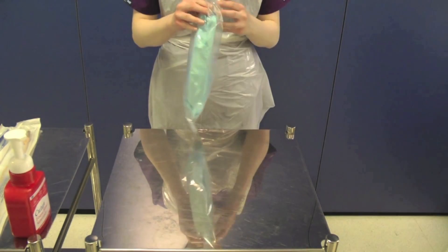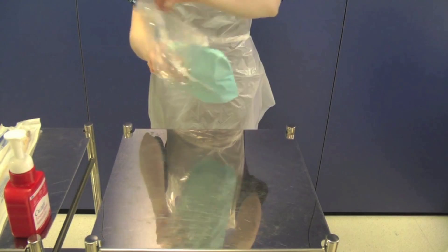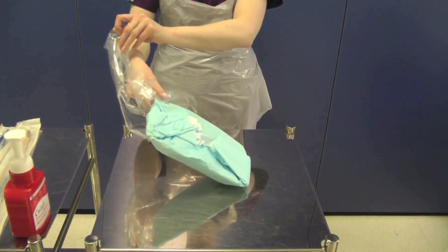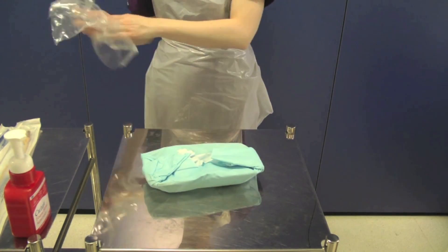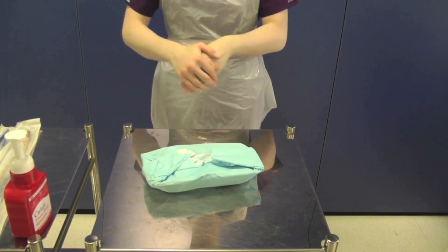Take your catheter pack and check that it is in date. Open the pack onto the trolley without touching the contents. You must decontaminate your hands as you have been touching outer packaging.